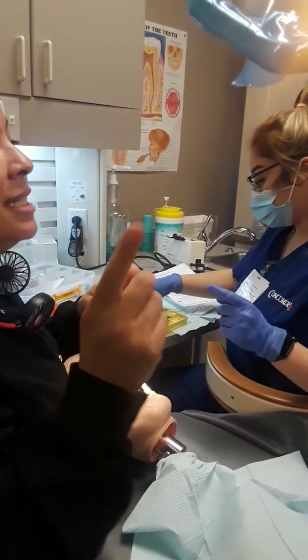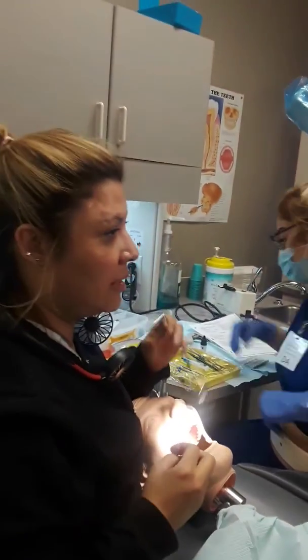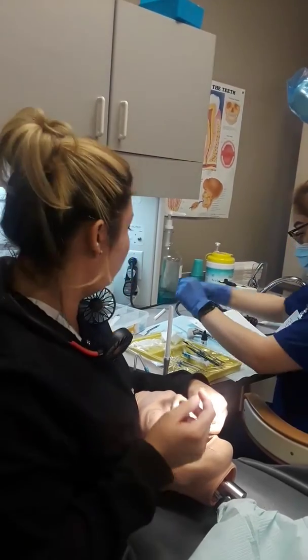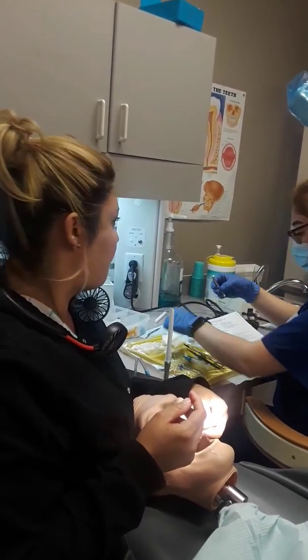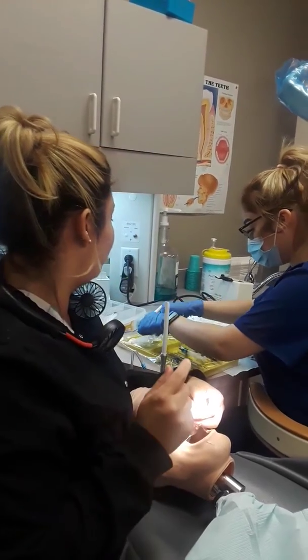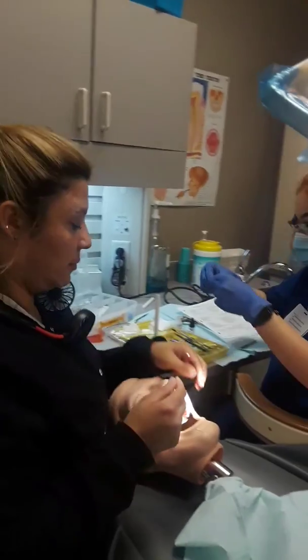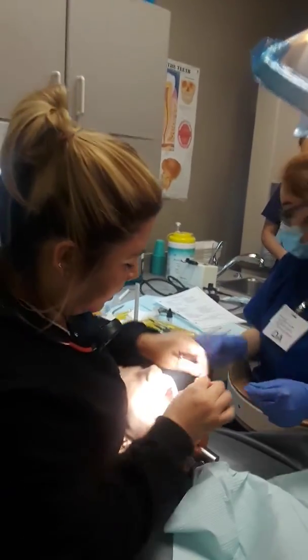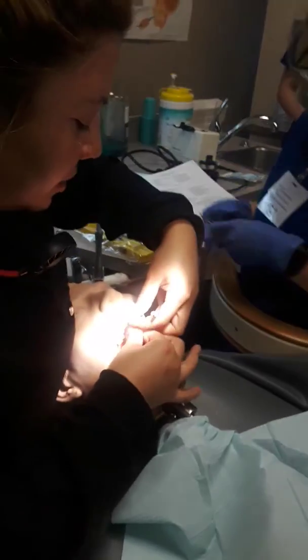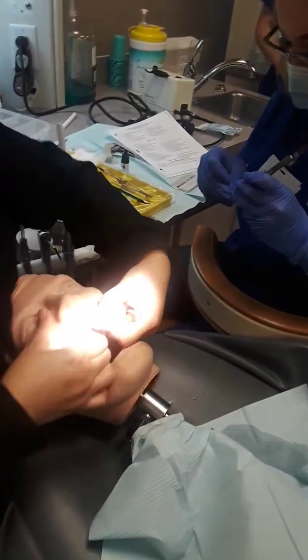We need to put the matrix on first. She's going to pass the matrix — add that to your note. I'm going to seat it right into my gingival sulcus. I need my wedge — we're going to wedge from the facial.